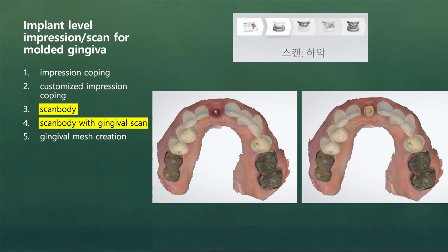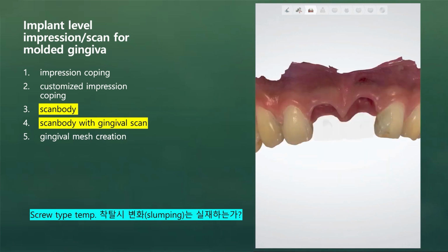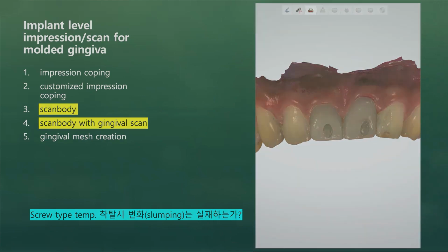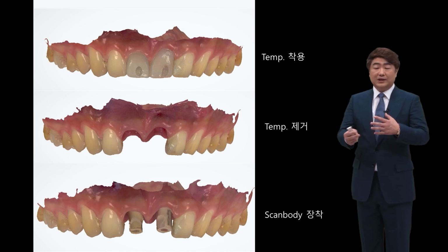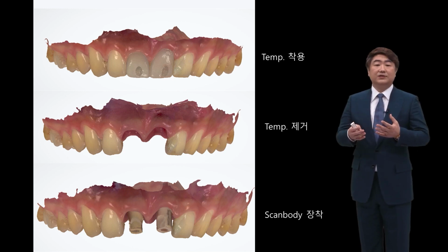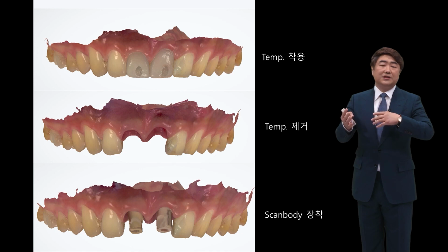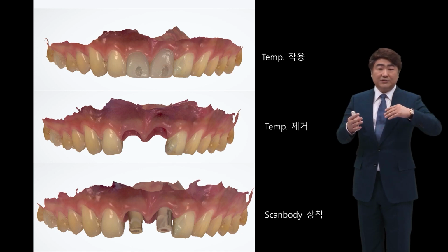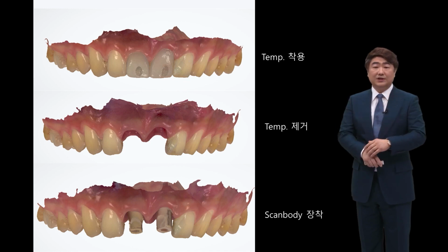Hence, would gingiva collapse not happen? Compared to using impression coping, what has become better? Actually, whether the gingiva collapse or slumping happens, let's compare. With digital technology, it's easy to compare through superimposition. So in the video, when you remove the temporary and attach the scan body, let's compare everything. These 3 scans, it's not just erasing the scan body, they are totally different scans on the gingiva area.